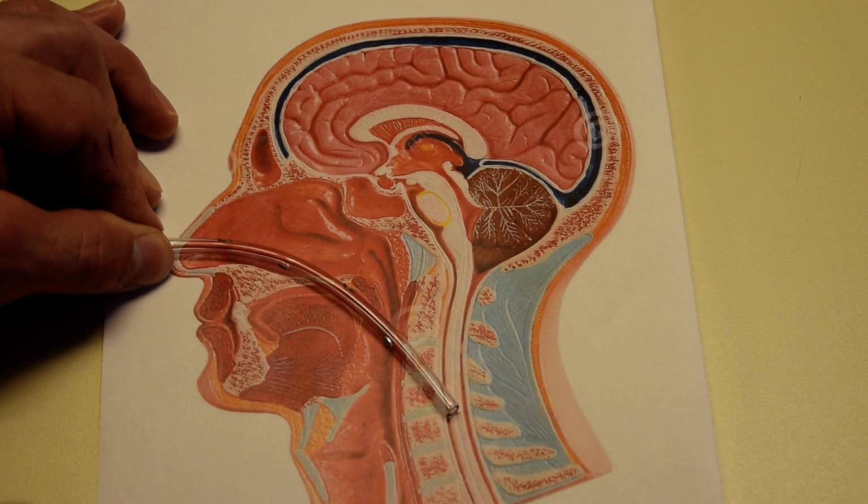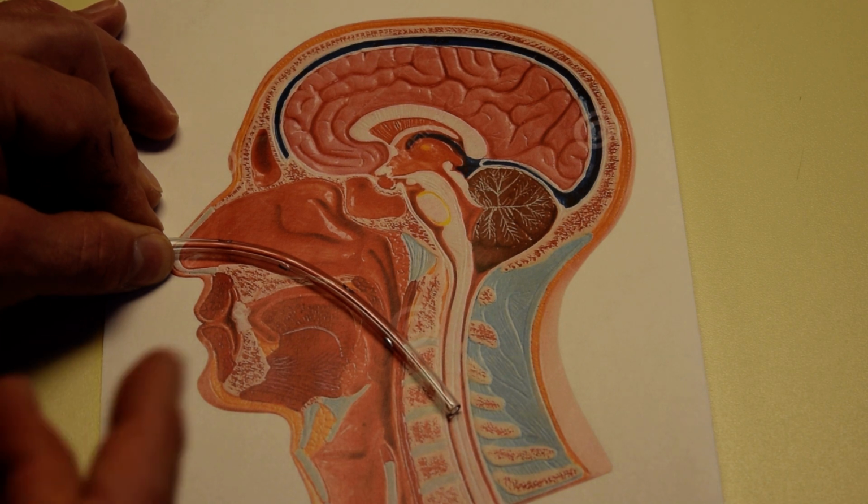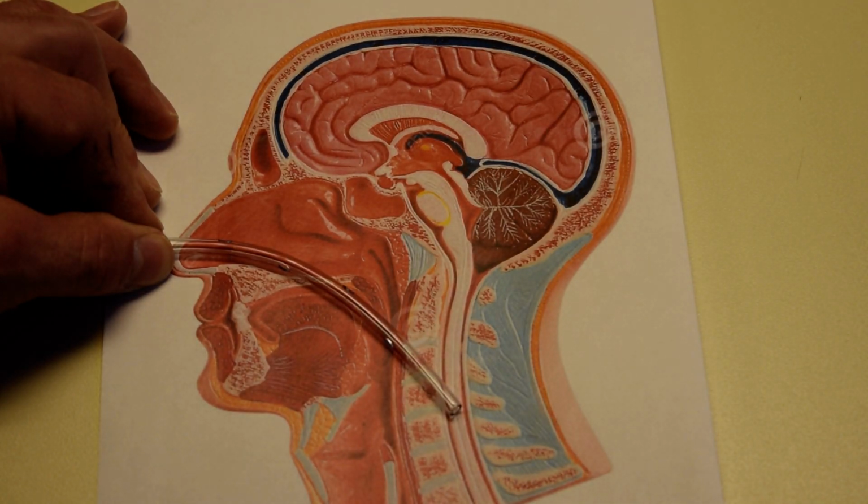Once you've relaxed your patient and you've confirmed with them that they're ready to proceed to the next step, this is where I oftentimes will describe to a patient to think of if they have mucus running down their throat, or if they're trying to swallow something, a phlegm or whatever in the back of their throat. When they feel something in the back of the throat there, they should try to grab at it and swallow it when they want to. Some patients can utilize a cup of water to do this. I caution with the cup of water, don't have people just chug water, as they're very likely to aspirate that water if you go too fast and they're not understanding what's happening.